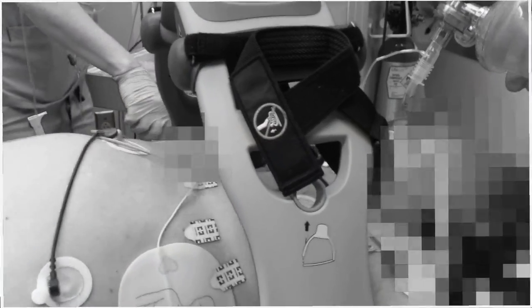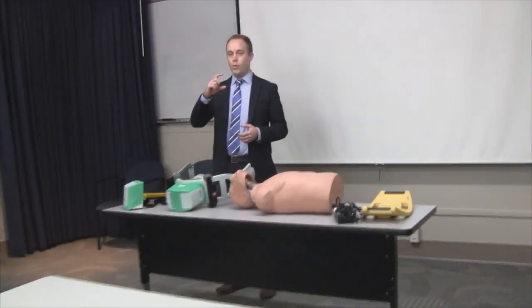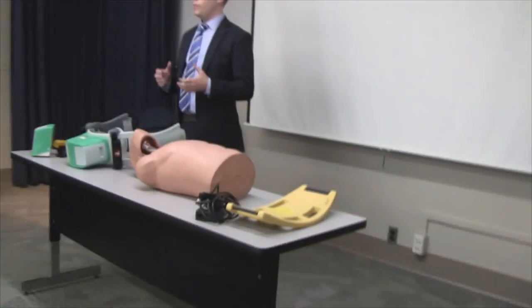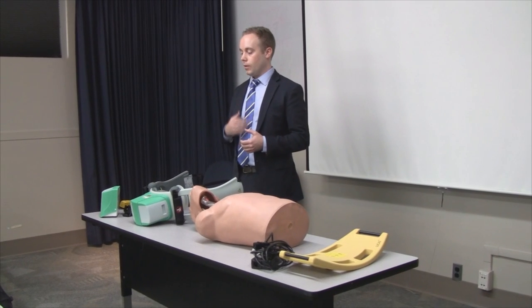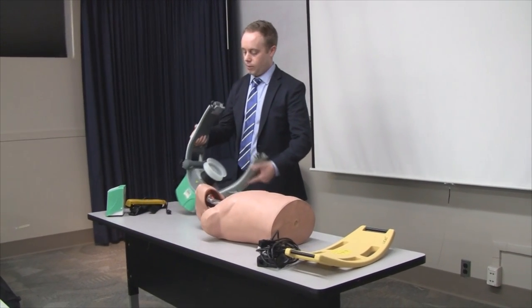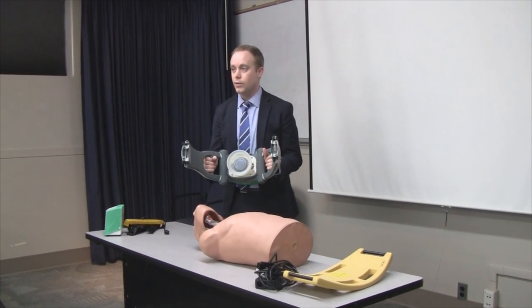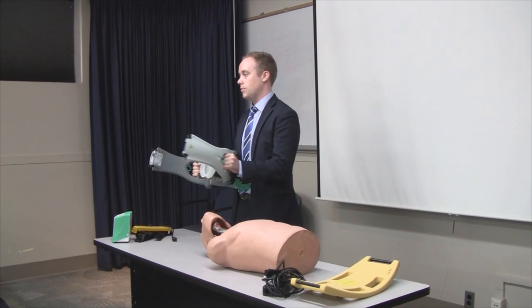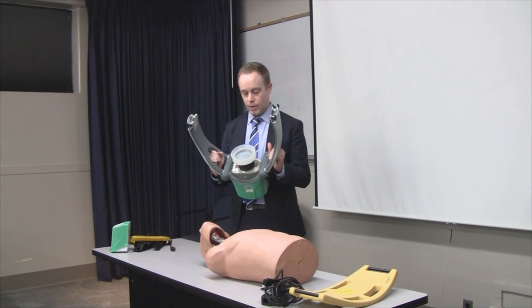This is the Lucas — it's a mechanical CPR device. It does perfect compressions per the AHA guideline: 102 compressions per minute, 2.1-inch compression depth, a full 50-50 duty cycle, so just as much time going down as coming up, and then full chest wall recoil, which is aided by this suction cup on here. Think of it as a machine that does perfect compressions for you, with the bottom of this piston mimicking the heel of your palm.